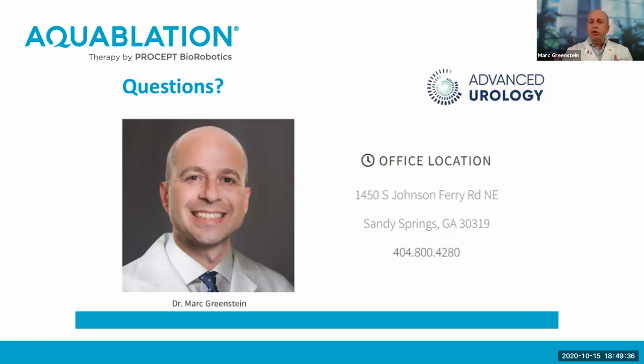And so the bigger the prostate, the more the resection. The nice thing about aquablation is I'm done in 45 minutes. The resection time is anywhere from 4 minutes to about 10 minutes. And so the chances of this side effect, this TUR absorption or TUR syndrome, is practically zero. And so that's why when we have a prostate that's really big, I think this is a great approach, because the alternative is open surgery, like an open simple prostatectomy, or a robotic simple prostatectomy. Still great surgeries, but now you've introduced more side effects into the type of surgery, because you have to open the patient up or put laparoscopic cameras in.